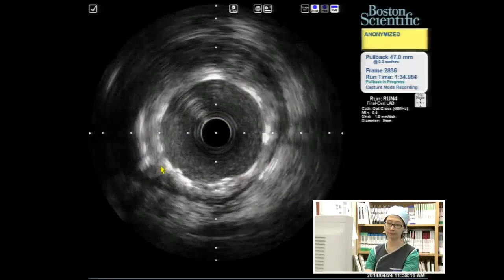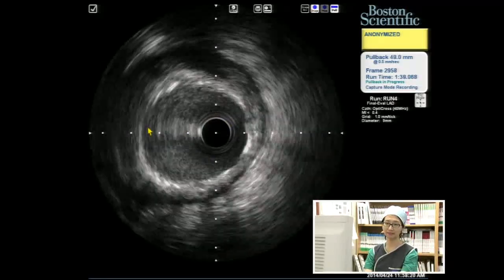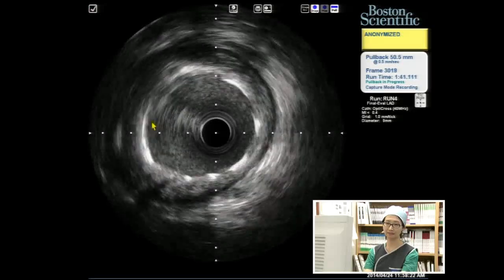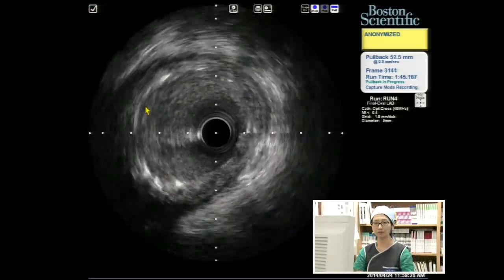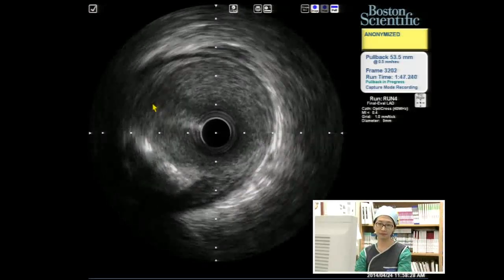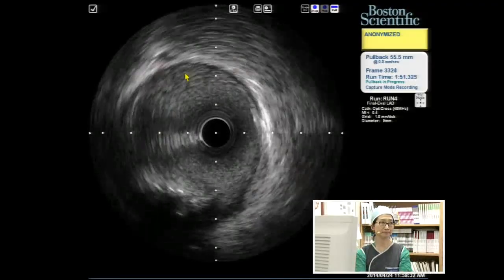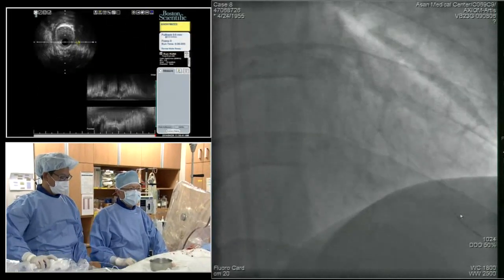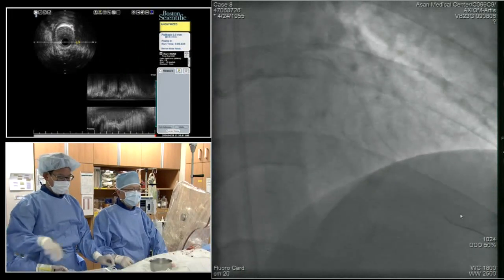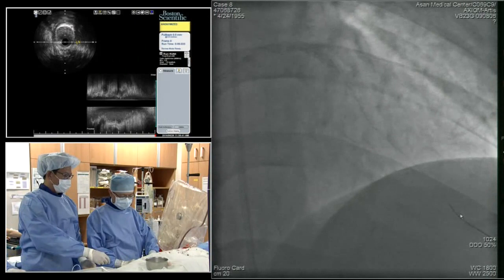It's really quite round and nice in the proximal left main there. Yes. Couldn't be better. Looks terrific. Looks good. Yes. And as we see this IVUS evolving, it's going to be about 30 seconds. Good. So yep. All done. Yep. It looks fantastic. Congratulations. Well done. Thank you. And I think this is really quite interesting in terms of looking at even criteria for doing anything. It is really kind of eye-opening.